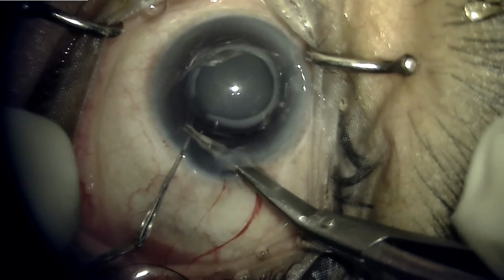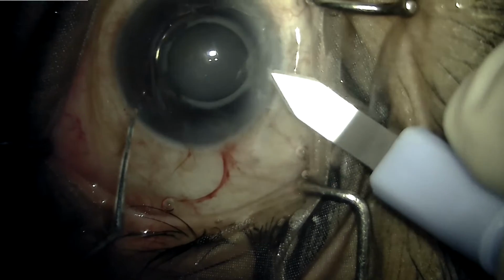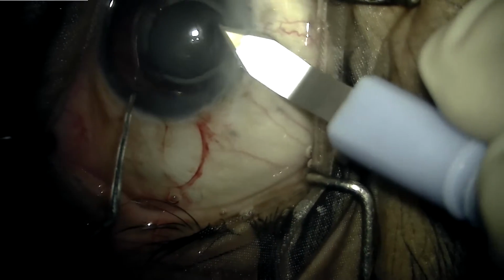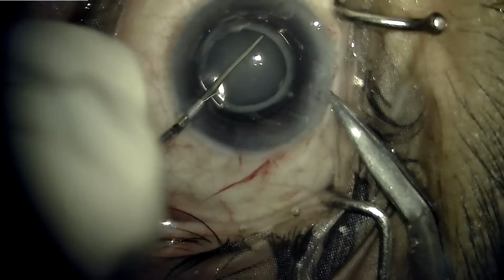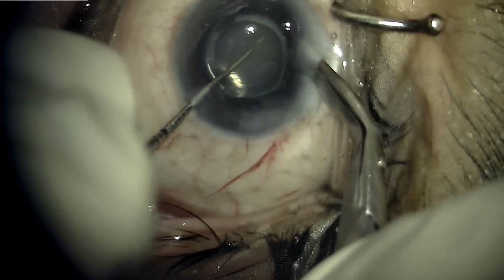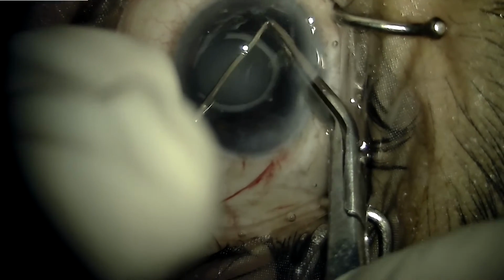the haptics. So this is the temporal haptic which is being truncated using a Vannas scissor with the help of a dialer, and I had to make another incision to approach the nasal haptic. Similarly, once we had a reasonable approach to the haptic, a Vannas scissor was again used with the help of a dialer to stabilize the IOL and to provide counter support, and the haptic was truncated using this scissor.